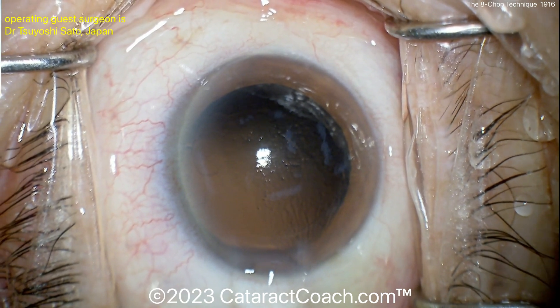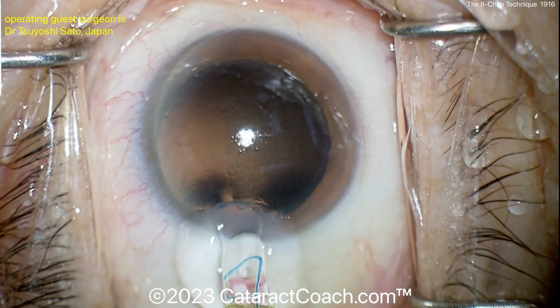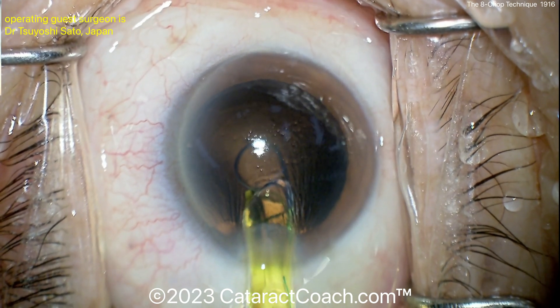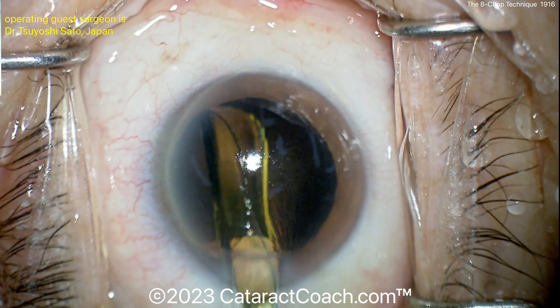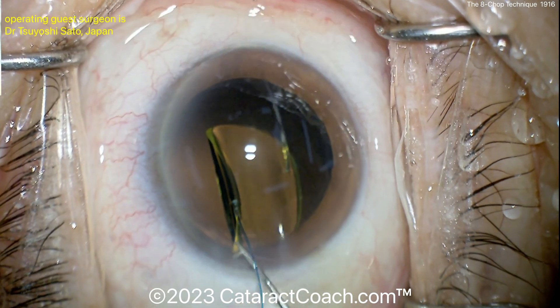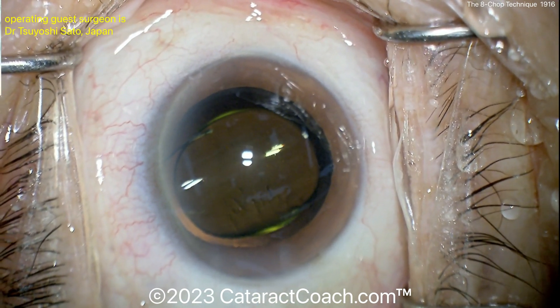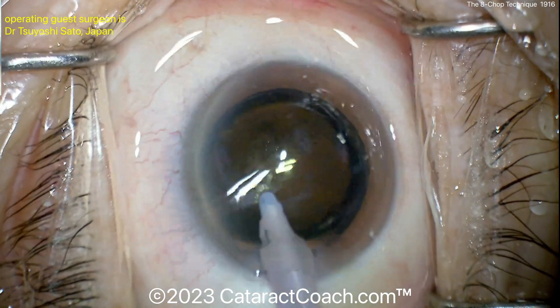Now the viscoelastic goes in to fill the capsular bag. It looks like a three-piece acrylic lens — here comes the leading haptic. Interesting to see how big the optic is compared to the rhexis. This technique of pre-chopping into eights is easier done with a sufficiently large capsule rhexis; with a small rhexis it could be tougher. But the lens looks great, in good position, everything looks very clean.